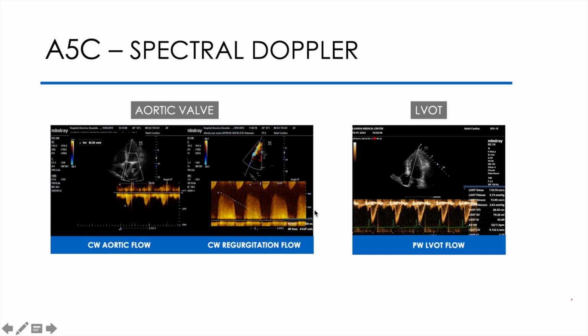Then I evaluate the left ventricular outflow tract flow. I activate color Doppler and I place it in the zone I want to study, left ventricular outflow tract. I set the focus to this level and adjust the color sectors so that only the flow I want to evaluate is left. We should also lower overall 2D gains.